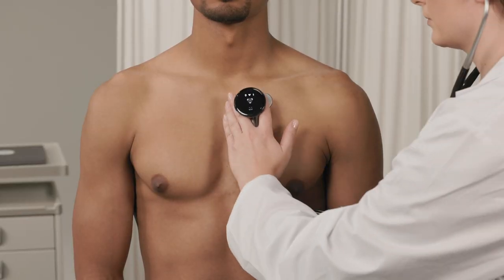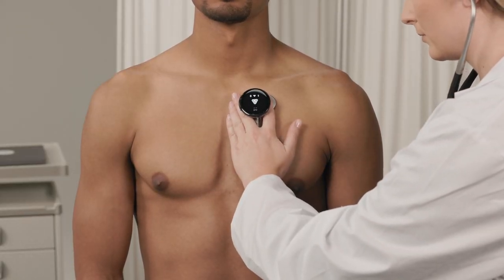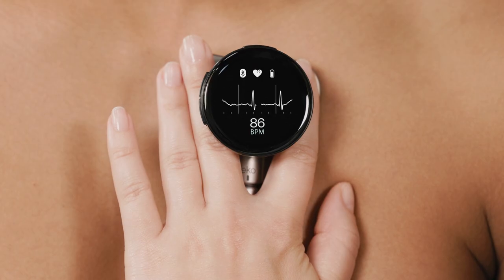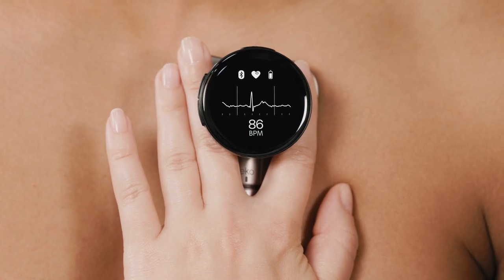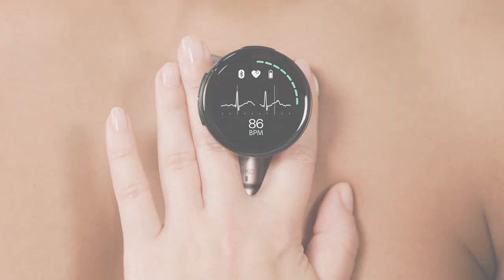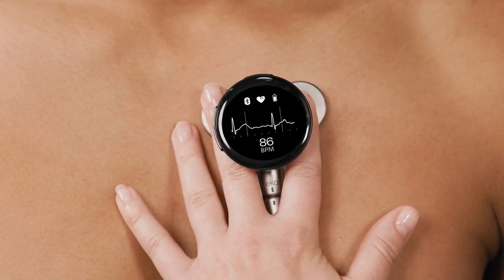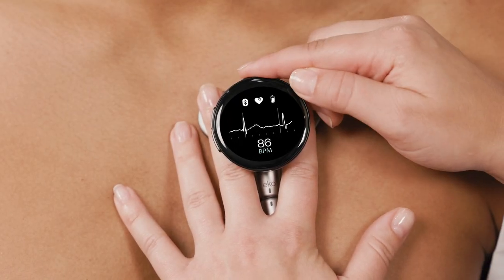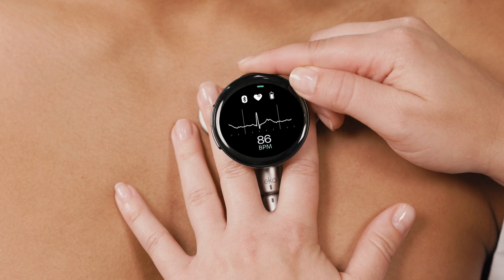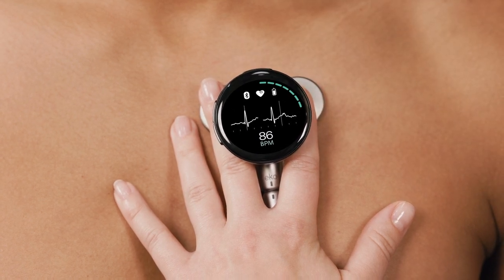Now let's take a recording. Place the device on the patient. Recording begins automatically if the Record Automatically setting is on. Or press the top button for 2 seconds to start the recording manually. The bars around the screen light up green when recording is in progress.